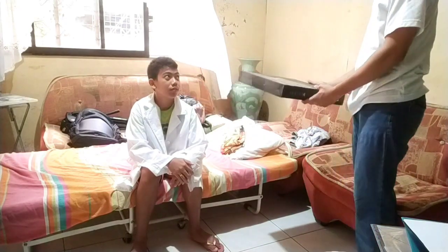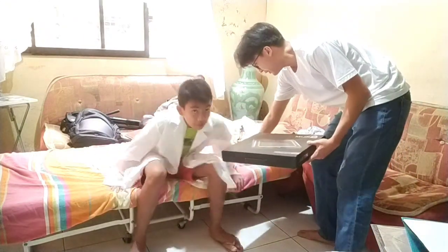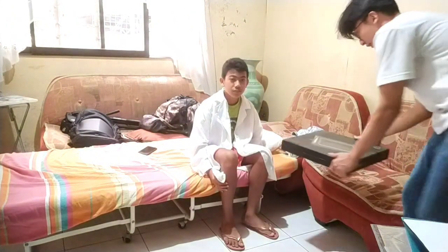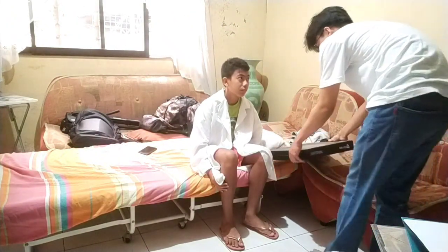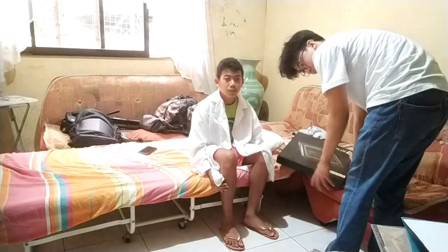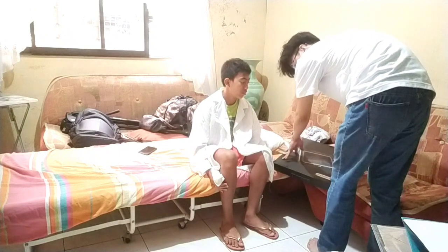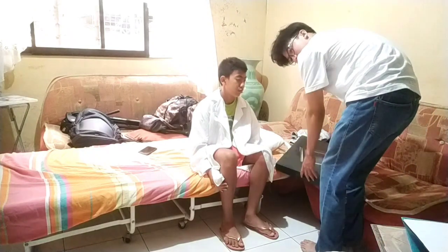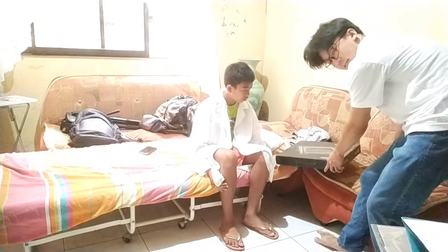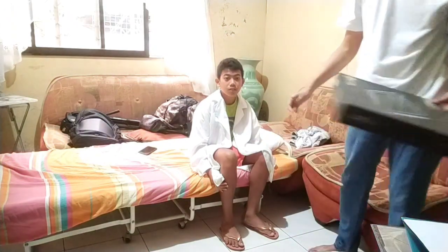So here, if the client is here and this is the wheelchair, what we're going to do is attach this here and to the bed. Like what you're going to have to assist the client to slide in this board to the wheelchair. And that's how you do it when you transfer a client using a slide board.